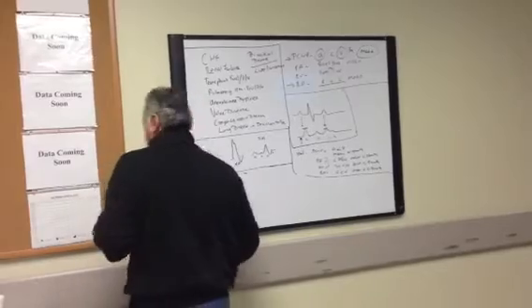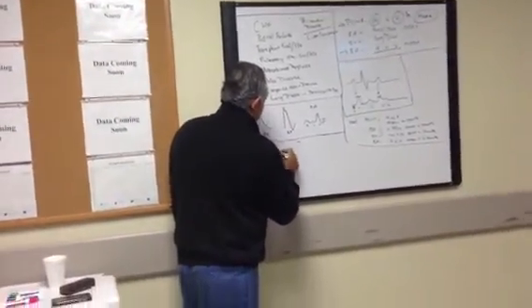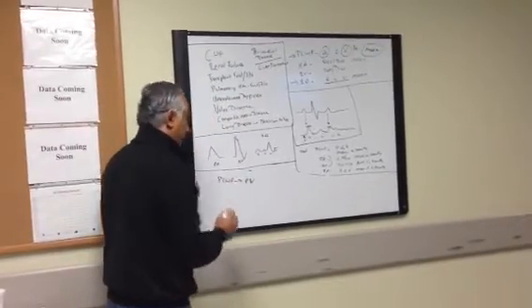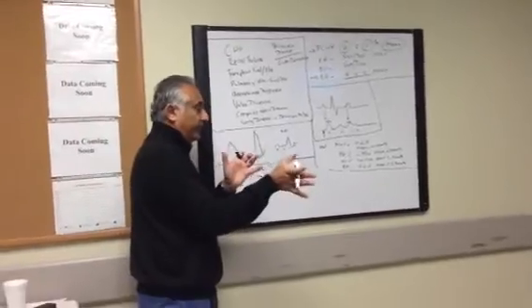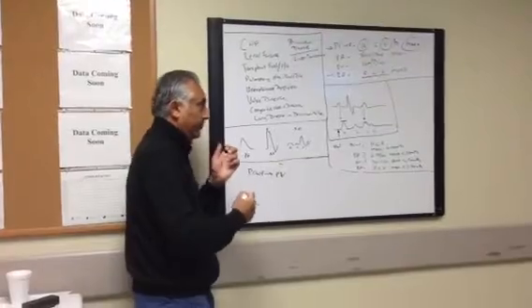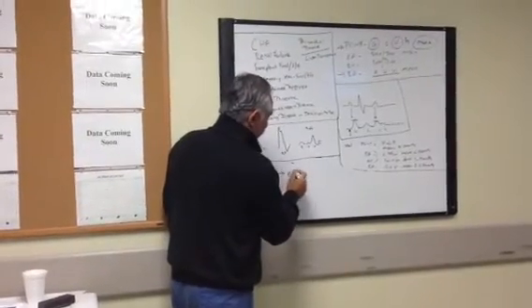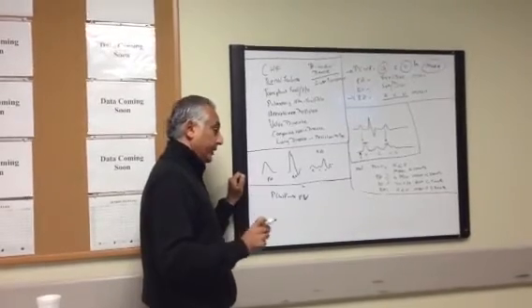because, so if I have a wedge sat, that is theoretically coming from where? The pulmonary vein, right? That's the whole idea because I'm pulling that blood. The idea is that my wedge sat is pulling the blood from the pulmonary venules that are going to form the pulmonary vein. I'm actually drawing blood from there because I'm wedged in, all right? Because technically, this is technically a pulmonary vein sat. So that is the most saturated blood that you're going to get.